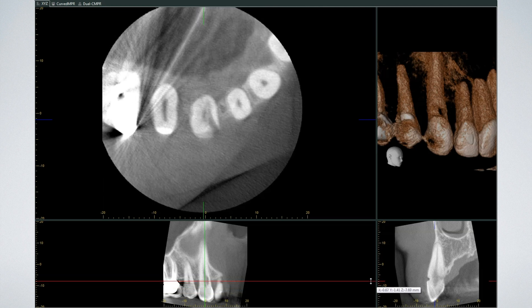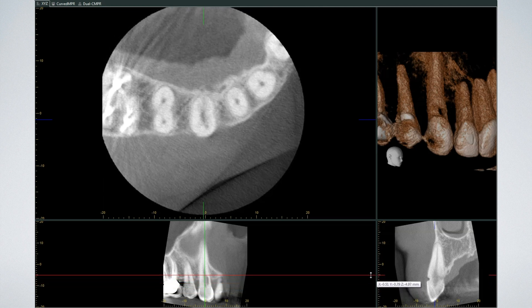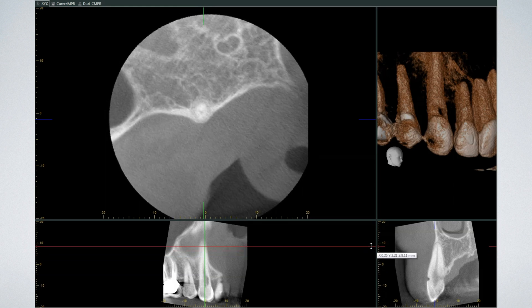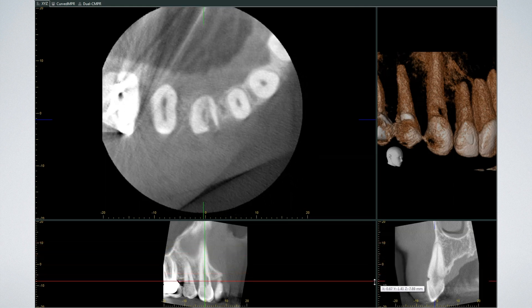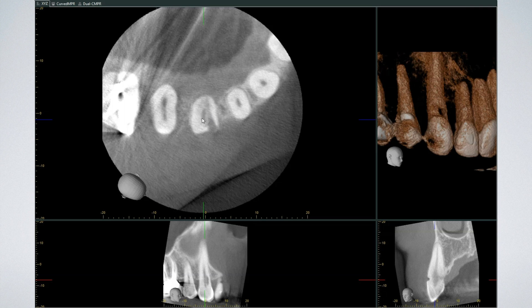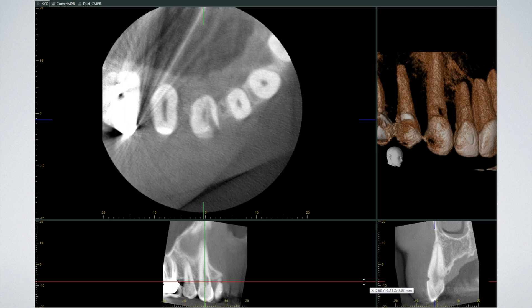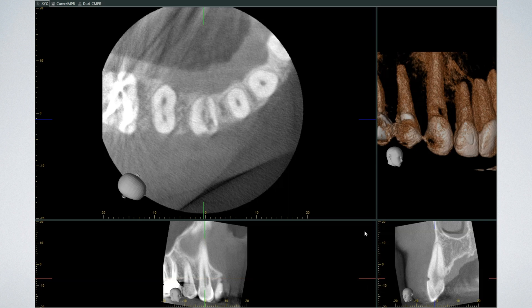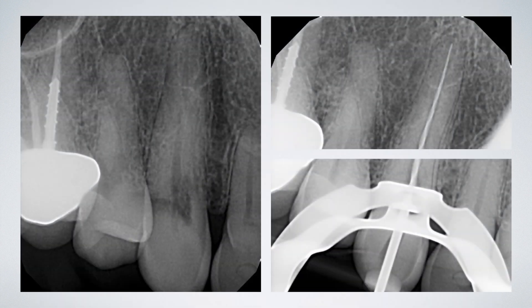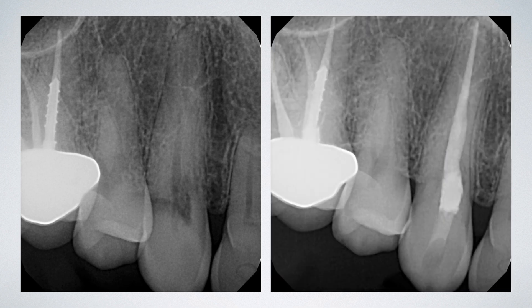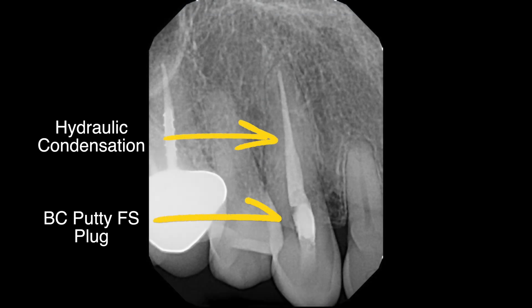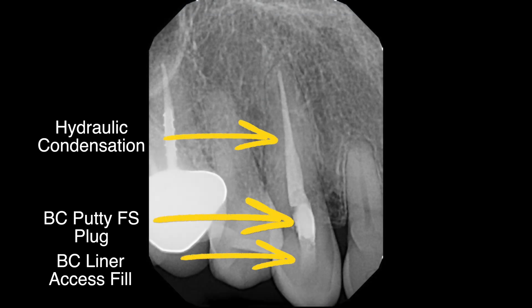Given that this tooth has a Heithersay classification 3 and almost 4 with resorptive defects surrounding the pulp, we always have to start from a non-surgical process. However, considering that this is almost transgingival and supracrestal, we also have to do a surgical repair, since food trapping in this area is a problem. We start with non-surgical root canal therapy using TCA — trichloroacetic acid — to cause coagulation necrosis of the resorptive cells beyond the area where we can reach, and root canal therapy is completed using hydraulic condensation.